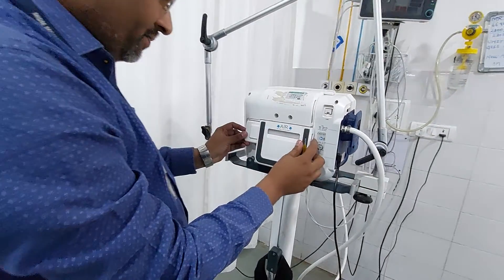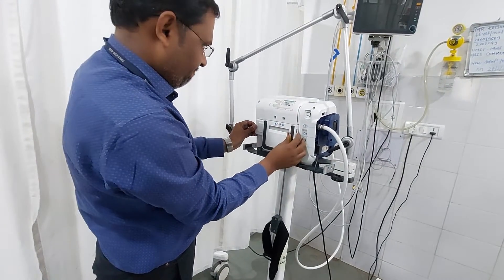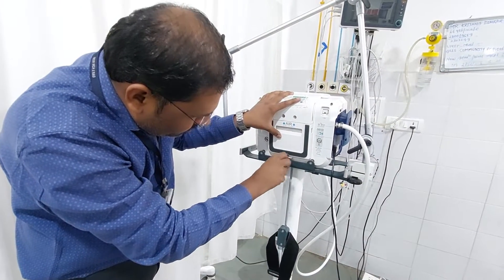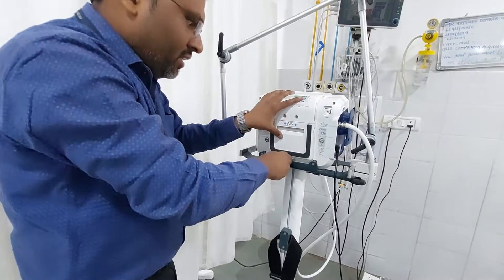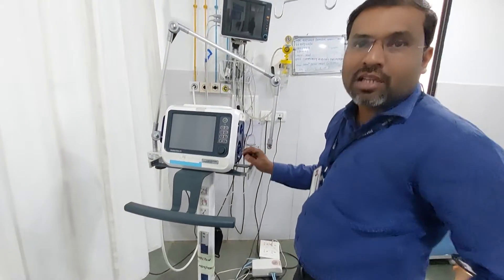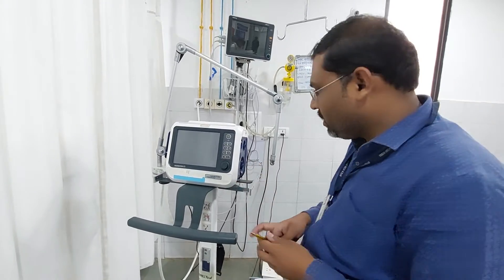Connect this cable, put this cover back, and tighten the screw. In this way we can replace the O2 cell. One more tip: after replacement of the O2 cell, make it a practice to write the date on the O2 cell so we can calculate the average life of the O2 cell.